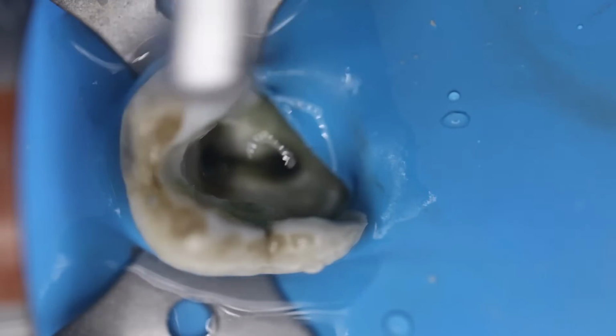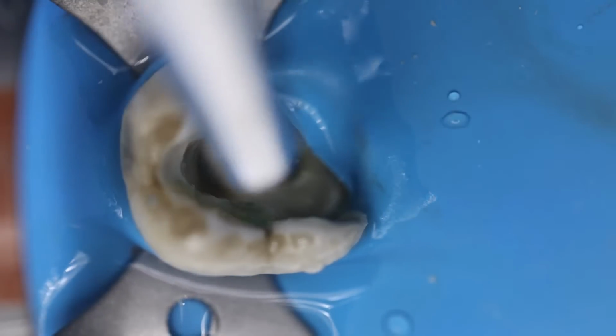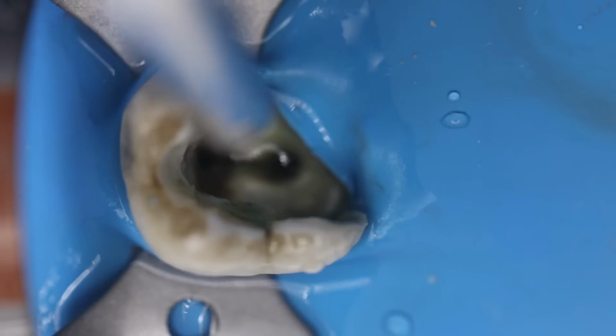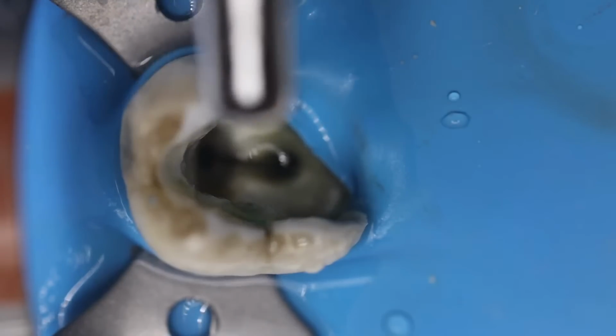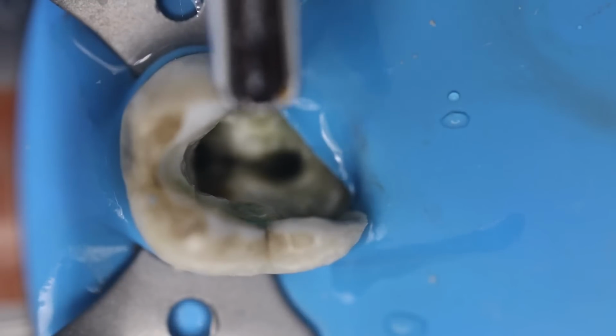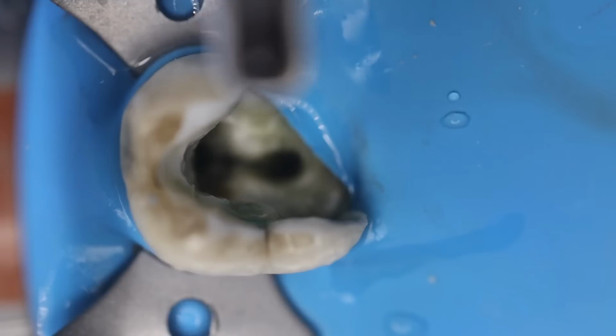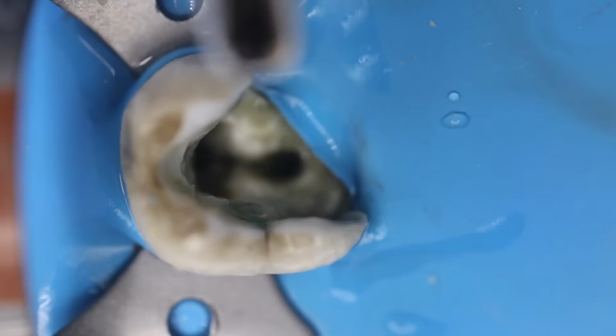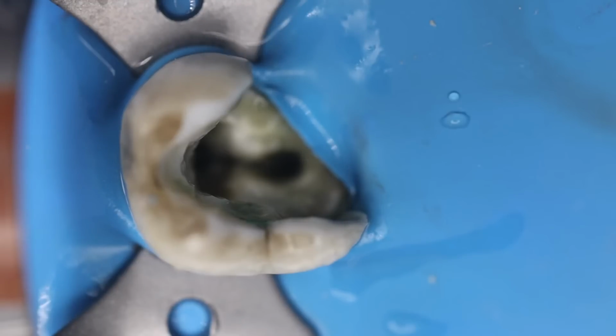Now when you have done this access, never use your 3-way syringe directly or blow into the chamber directly. You have to tilt it horizontally like this and then blow, so that you don't give any pressure or any air into the canals that are still viable, and this will help you in safer treatment.